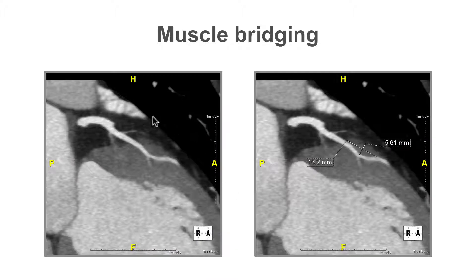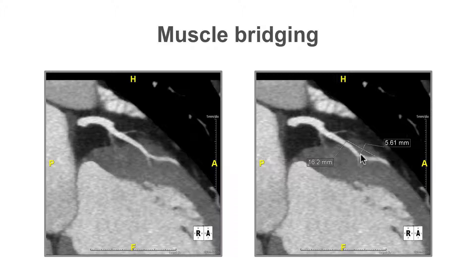Here is an example of the muscle bridging from this case. We can see that the coronary artery passes in the epicardial fat over the surface of the epicardium, before diving down into the myocardium and emerging out again. When evaluating muscle bridging, it is customary to measure not only the length of the muscle bridge, but also the depth. Note also that the calibre of the myocardial bridged segment is smaller than that of the normal unbridged segment proximal to the muscle bridging.